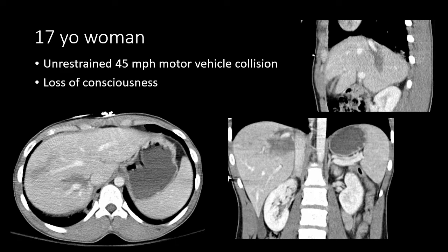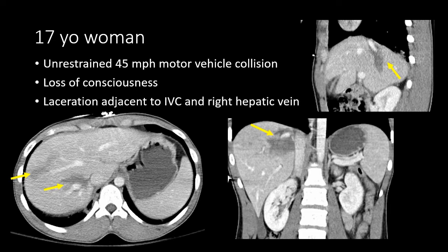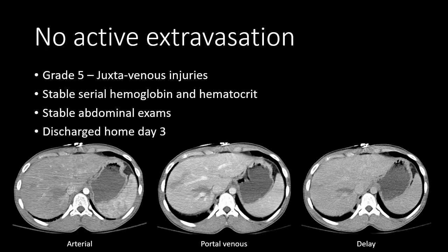Here we have a 17-year-old woman, unrestrained driver in a 45 mile-per-hour collision presenting with loss of consciousness. We can see multiple injuries to the liver — areas of hypo-enhancement or low density within the liver, which may qualify as contained hematomas, but this is more of a laceration with an associated hematoma. In coronal and sagittal views, that laceration or hematoma encompasses the right hepatic vein and extends right up to the IVC, indicating central venous involvement.